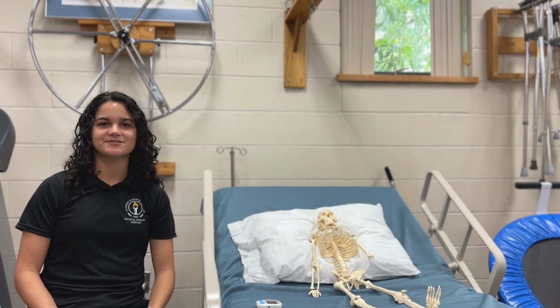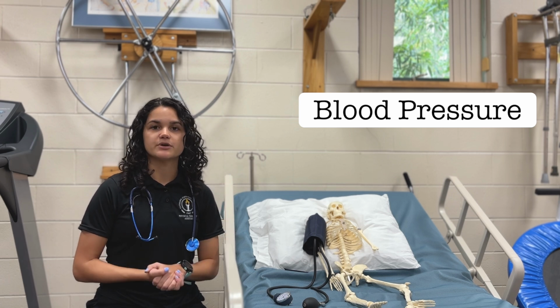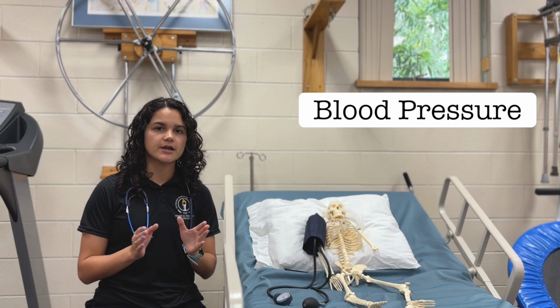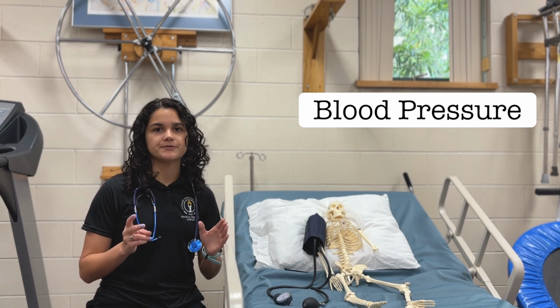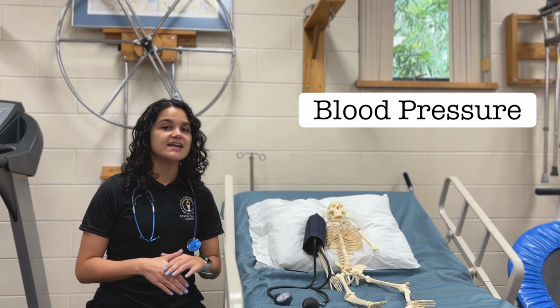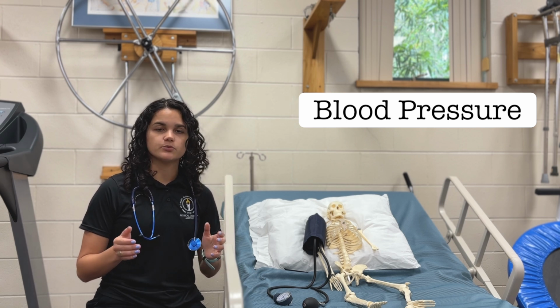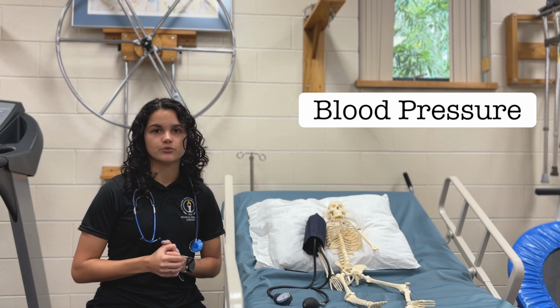On to blood pressure. When you measure a patient's blood pressure, you are measuring the amount of pressure that the blood is exerting on those vessel walls. There will be 2 numbers involved. There will be a diastolic number and a systolic number. The diastolic number will be the lowest pressure that is exerted on the walls, and the systolic pressure will be the highest pressure exerted on the walls.